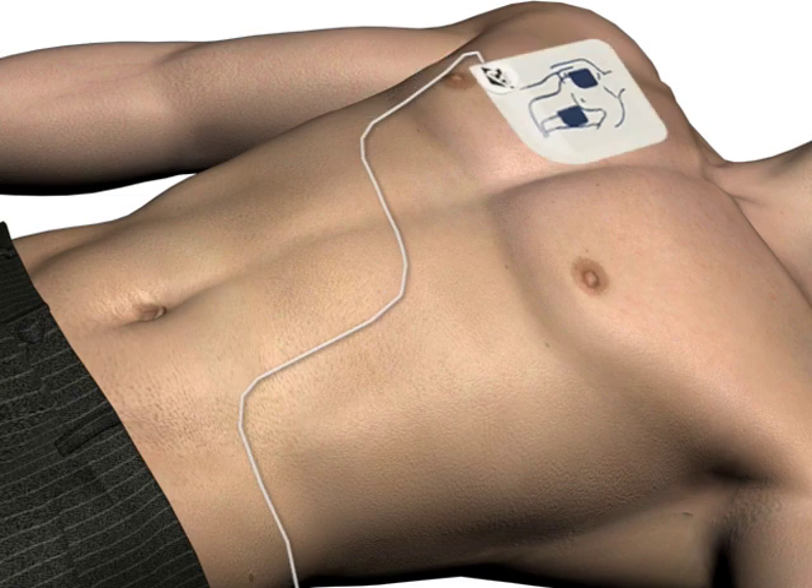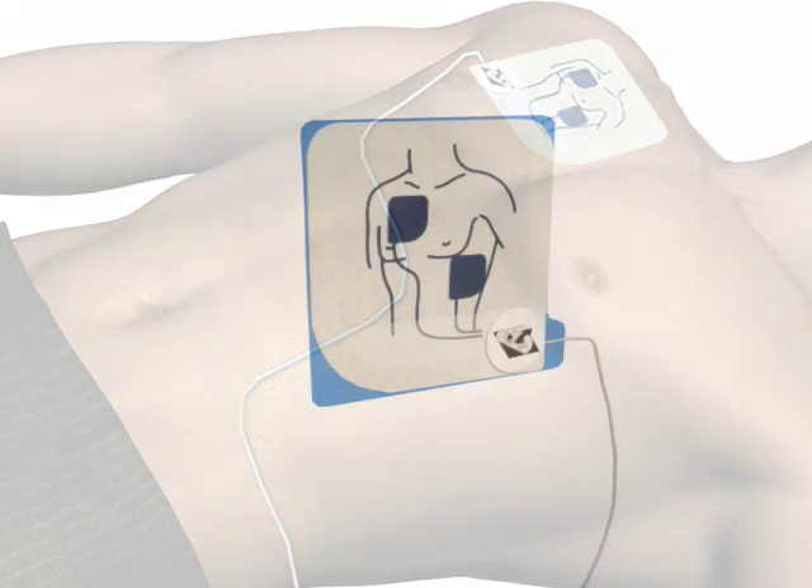Firmly place the pad without the liner on the patient exactly as illustrated. This pad can be placed on either of the two locations shown.